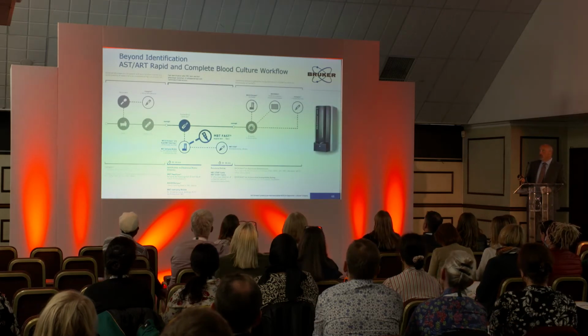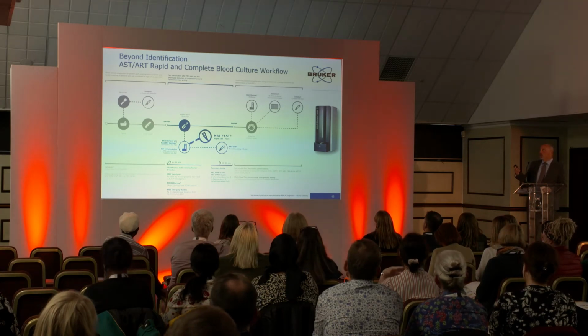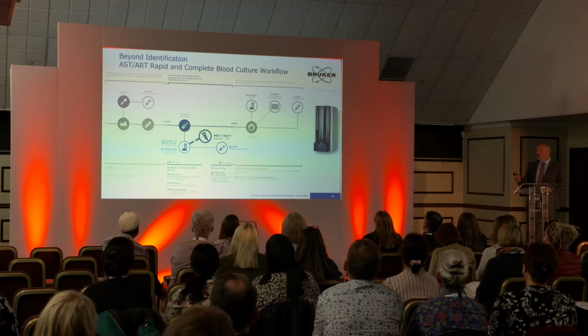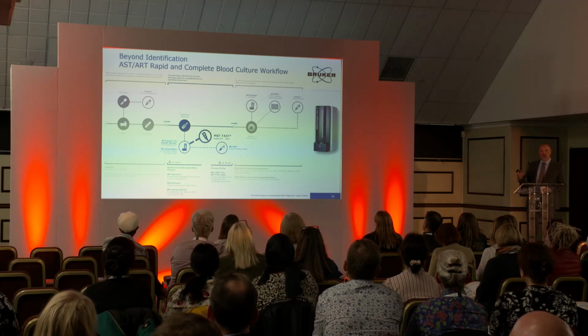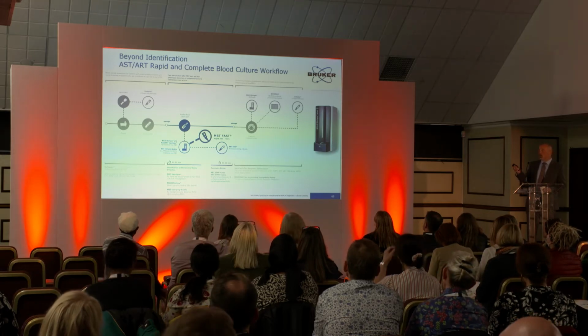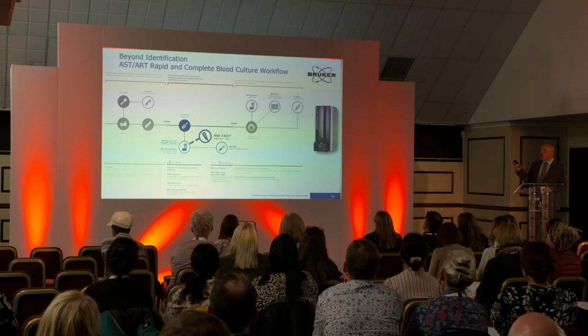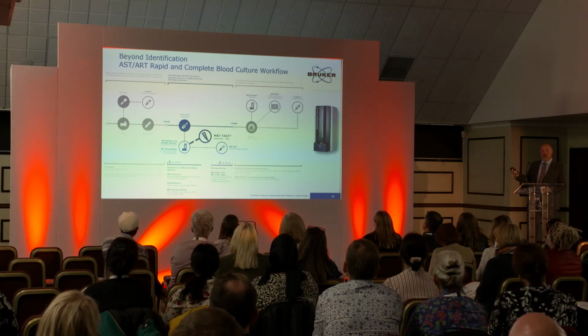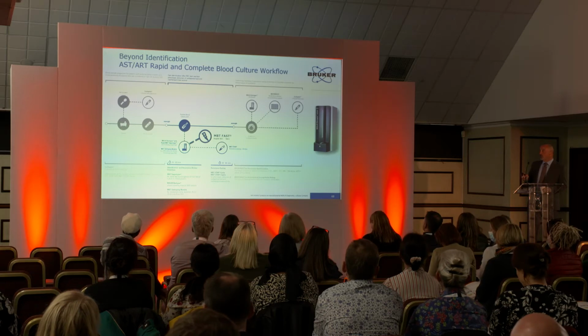Apologies for a bit of a busy slide, but this sort of demonstrates how busy Bruker are at the moment, in that they're moving away from just being known as an identification company and an instrument company, with the introduction of new methods through acquisition and through research and development, starting from the patient journey with pre-admission screening, using molecular techniques for things like CPE carriage, through the blood culture pathway, where they're also directly from the Sepsityper sample able to do some antimicrobial resistance testing using the STAR kits, which Francis will talk you through, right through to the following day with confirmatory testing.